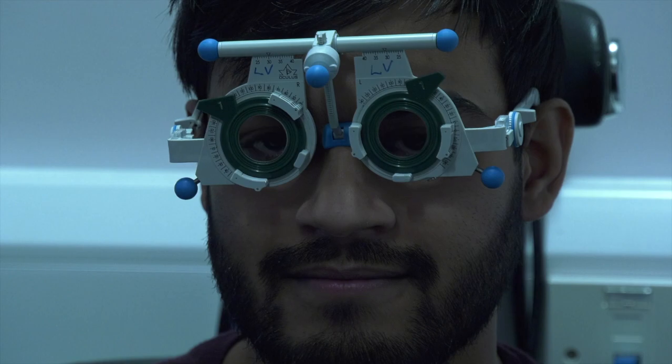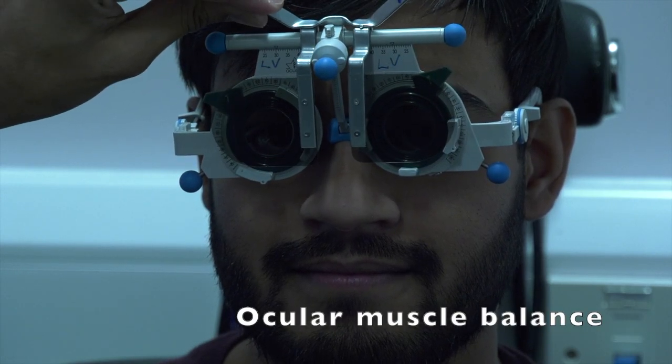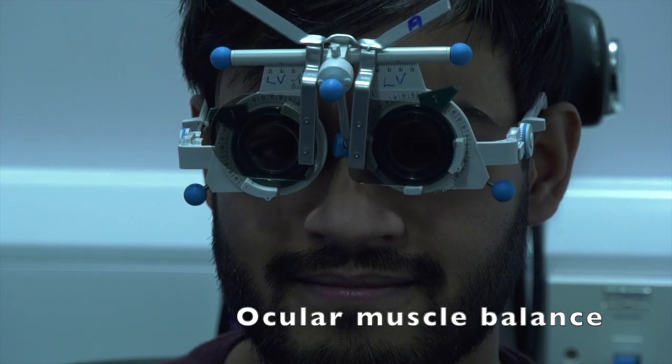The balance of your eye muscles is checked with lenses placed in front of your eyes, and you will be asked to judge the alignment of specified targets.